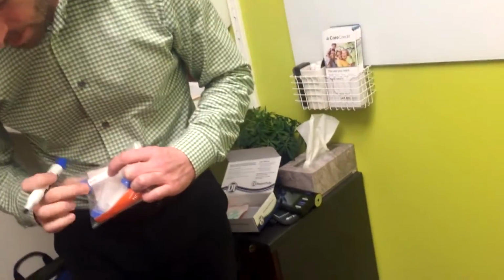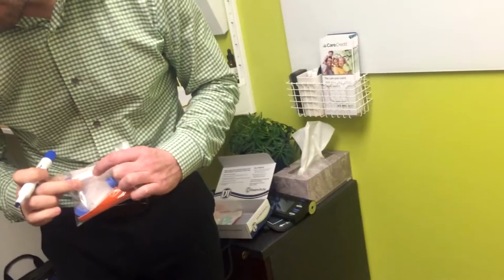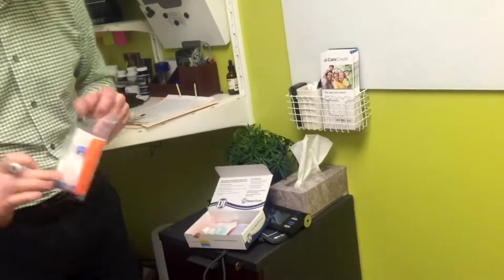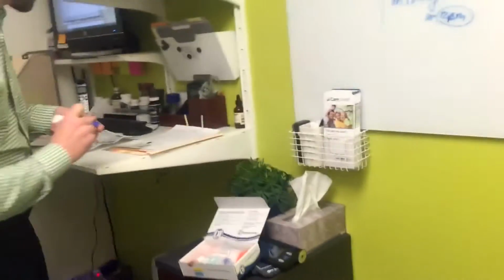And so be sure to put on each of the tubes your name and your date of birth with a little Sharpie marker so that they don't misplace anything. Do they also want the specific time that I took it? Yep. And where you'll mark that is on this form.